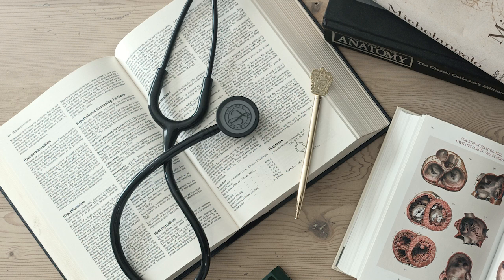This means the atrial activity, P waves, and ventricular activity, QRS complexes, are completely dissociated. Completely separate lives. Totally. The P waves occur at their own normal, regular rate, driven by the SA node, completely independently of the QRS complexes, which represent the ventricular activity. The ventricles only depolarize through a slower escape rhythm originating from a lower pacemaker, such as the bundle of His, or tissues further down in the ventricles.